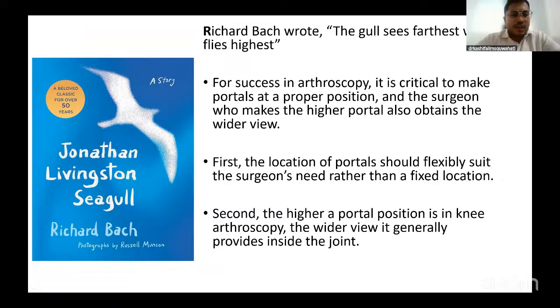This was from a quite popular classic book, Jonathan Livingston Seagull by Richard Bach. And he wrote, the gull sees farthest who flies the highest. So basically, for success in arthroscopy, it is critical to make the portals at a proper position, and the surgeon who makes the higher portals also obtains the wider panoramic view, like the gull.